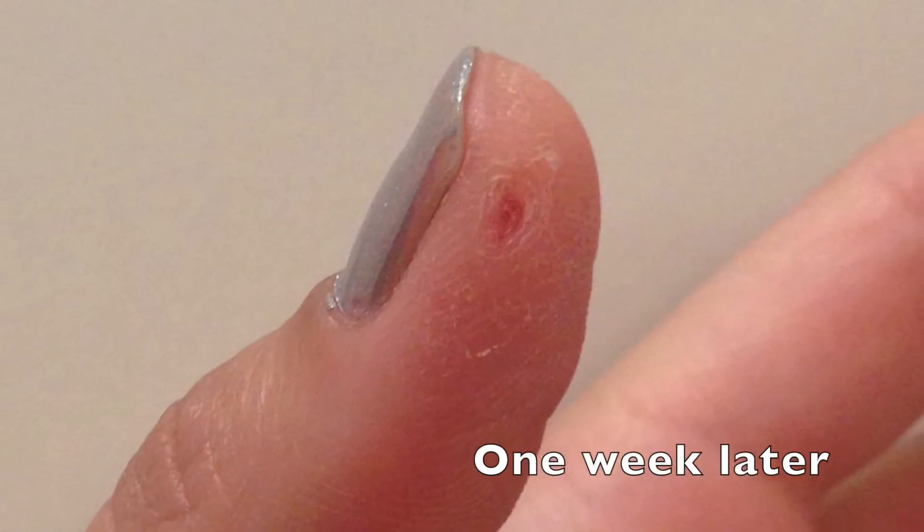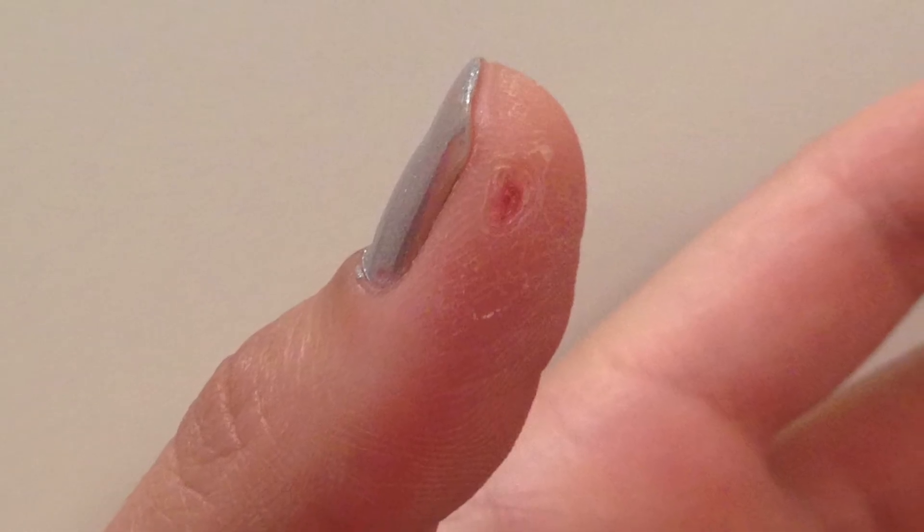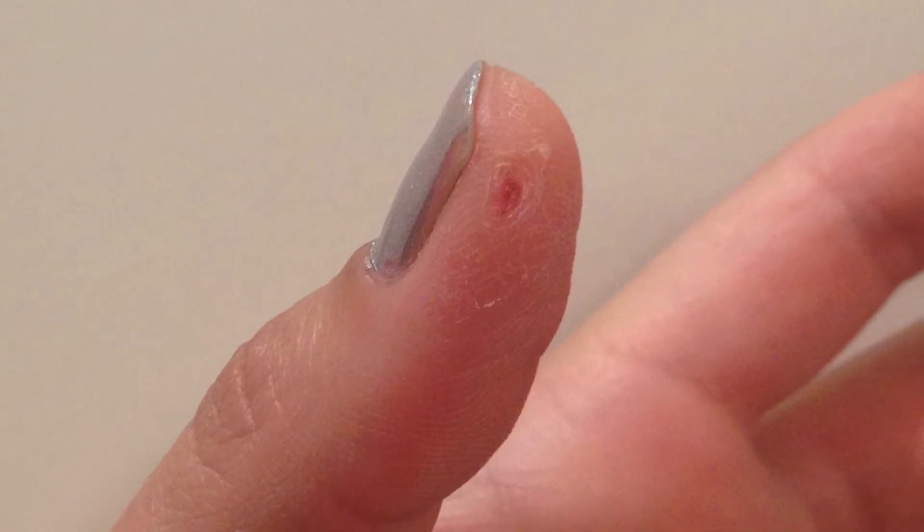Like any layer of tissue adhesive glue, it will fall off in approximately a week and you'll end up with this nice clean scab with no further bleeding from the wound site.